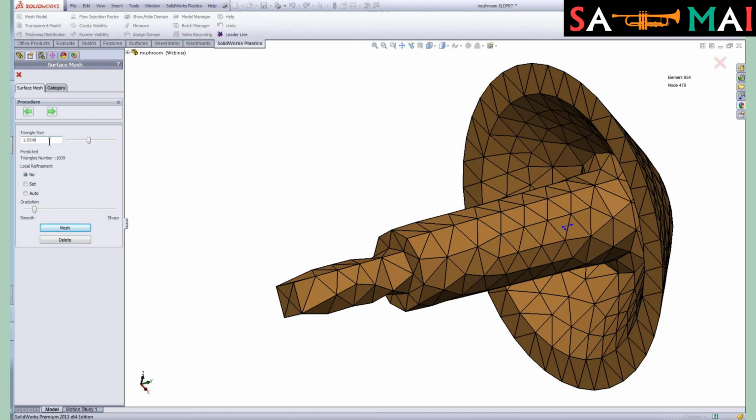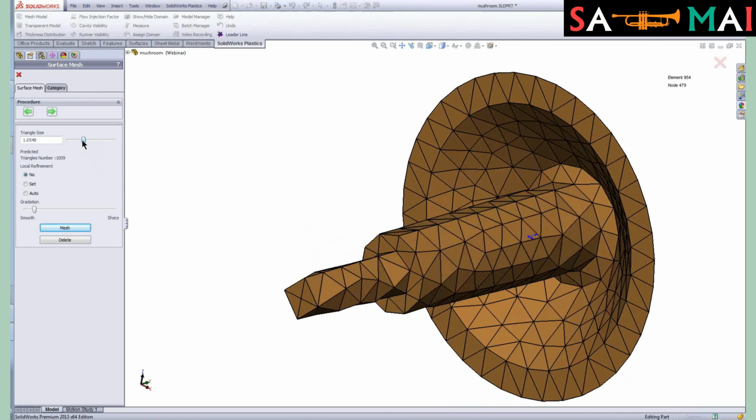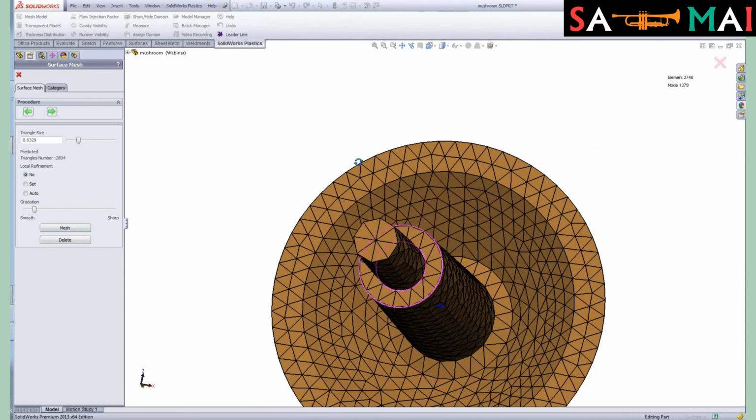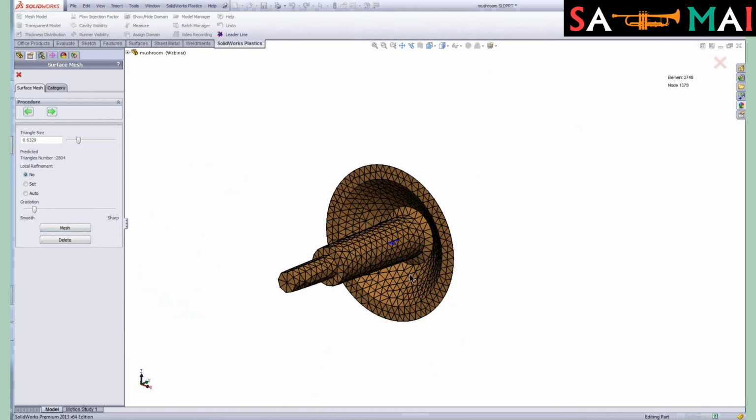Now what you'll notice here is I have a fairly large triangle size, and clearly these features don't quite look like the part. So what I can do is refine that mesh size just a little bit, mesh it again, and you can see there that it looks a little bit closer to what we're really looking for as far as the true volume and shape of the part.